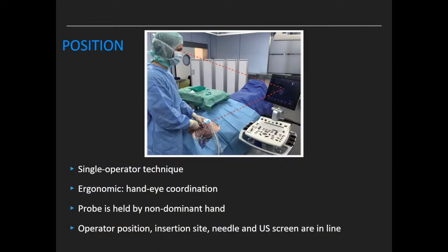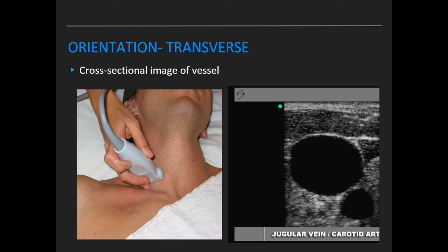The most important factor determining first-attempt success is good hand-eye coordination. This procedure is performed by a single operator, with the ultrasound probe held by the non-dominant hand while the procedure is done with the dominant hand. The operator, insertion site, needle, and ultrasound screen should all be in a single line. Prior to prepping and draping, orientate to the vessel in both transverse and longitudinal views.